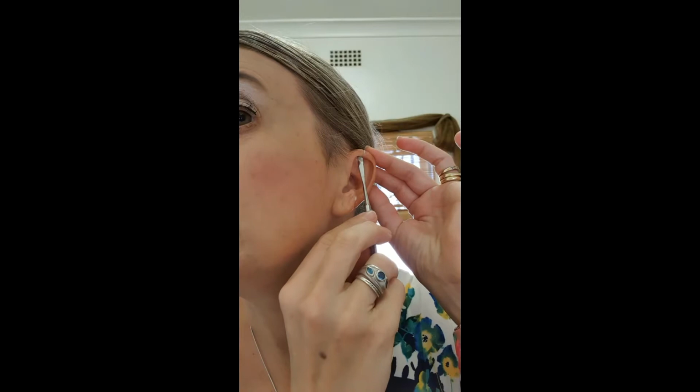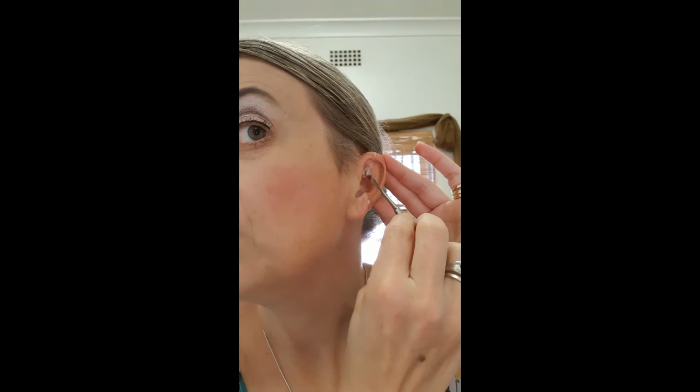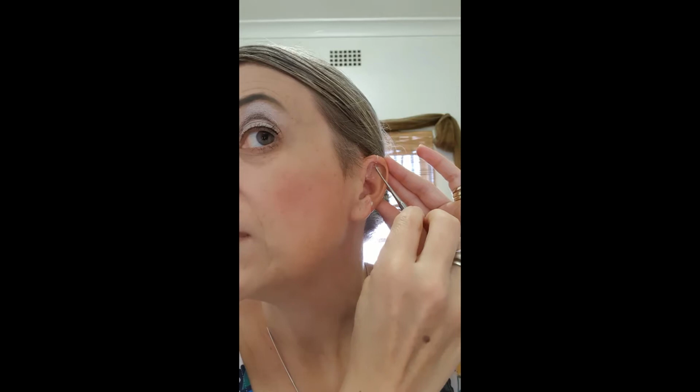I'm going to scoop some of this wax out, and the trick is to hold the ear on the back, otherwise it won't work and you'll ruin it, and to actually squish that right in to see to what extent I can hide that gap. Now as I go, I need some more wax every now and then. You'll also see I will wax carefully so that I don't unravel this joint that I battled earlier with. Now you can also see the wax is lighter than my ear.